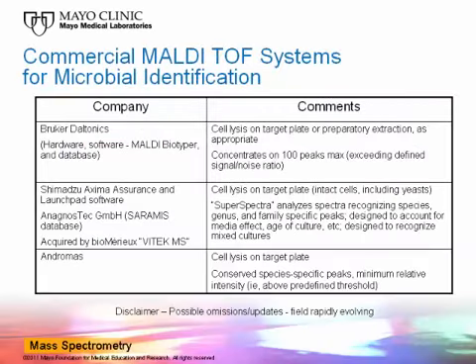Multiple commercial platforms are available. The most studied system is that from Bruker Daltonics and includes a mass spectrometer along with the Biotyper software and database.